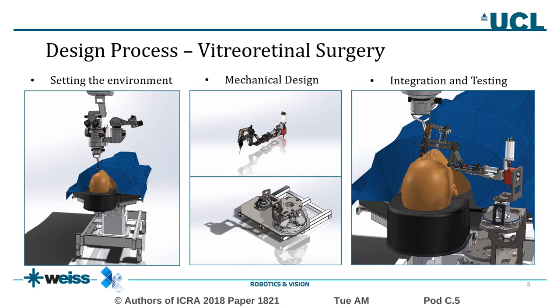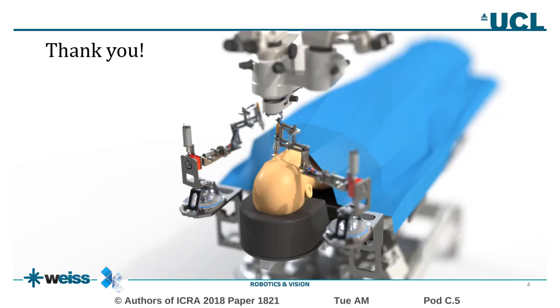To conclude, we believe that the presented dynamics-directed design process will eventually lead to the selection of an optimal robotic solution, as it gives us the chance to choose an appropriate level of customization, keeping the dimensions within the range that would fulfill the requirements of retinal surgery. So that was a brief description of the key ideas that you'll find in our paper.